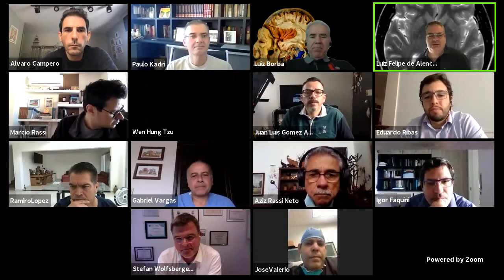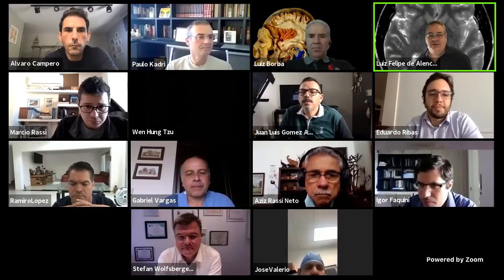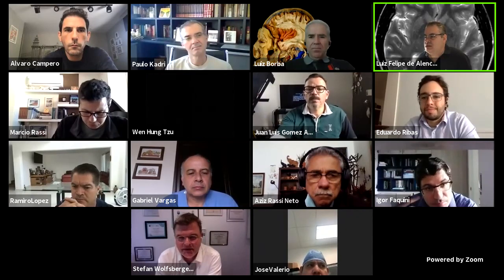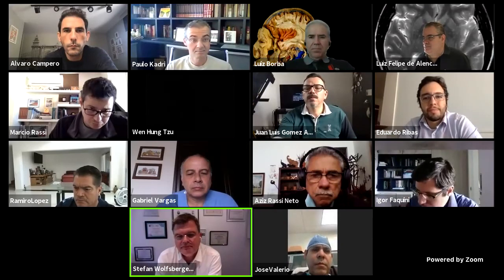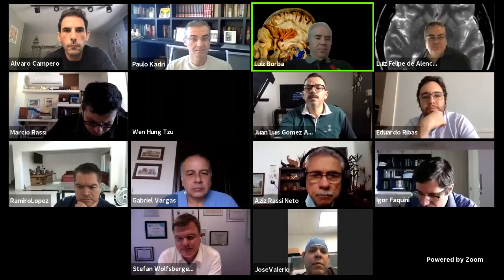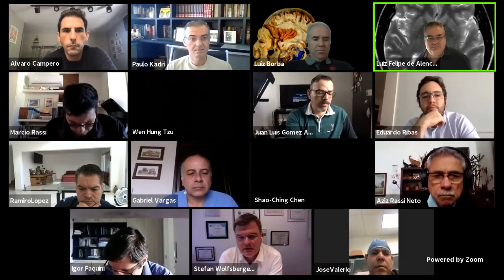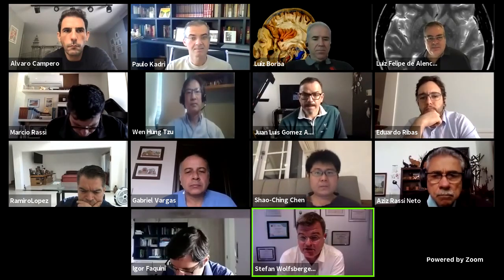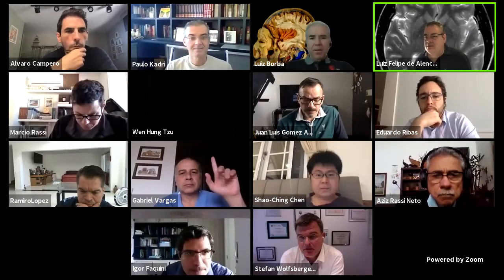Dr. Stefan, there is a question here from Dr. Rena. He asks you, how can we get the 3D brain image? What kind of station do you use? What equipment is it, GE or Siemens? No, this is all from Medtronic StealthViz, the DTI software, S7 or S8. But it's StealthViz, this tractography tool. All right. Great. Thank you.